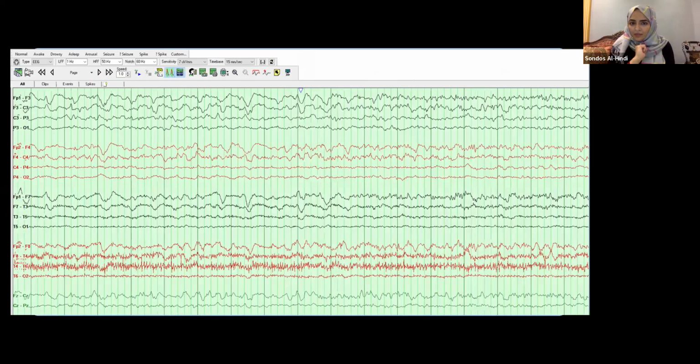We got this EEG. Before going to the EEG, off propofol and just on a small dose of fentanyl, to be honest, it wasn't really an agitation. There was some biting on the tube, but the patient wasn't really moving much, and his blood pressure kept spiking up. There wasn't any abnormality or movement. So off propofol on fentanyl, the clinical examination at that point was really absent brainstem reflexes and no motor response. He was technically a GCS 3 to me with absent brainstem reflexes, nothing.